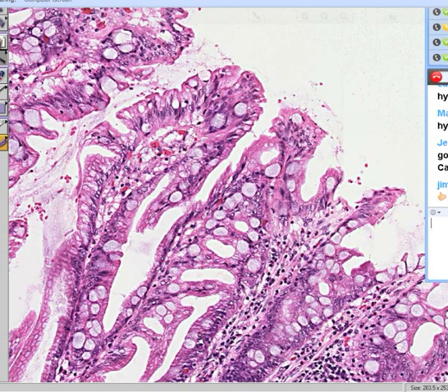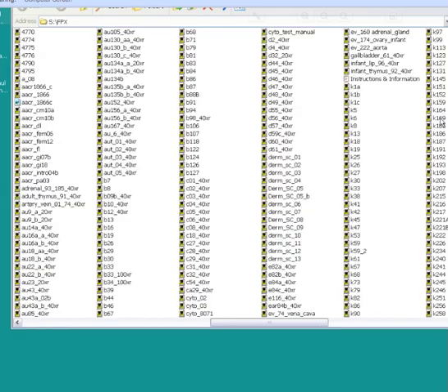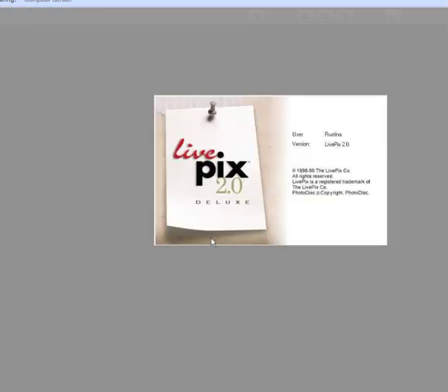Okay. Did everybody get that case? And can everybody see the big blow up right now as well? Okay, good. Let's move on to the next case. Let's go to case number K169. And I think we might have seen this slide before somewhere along the line. But let's look at it again.